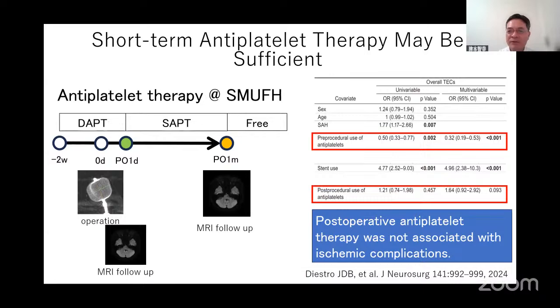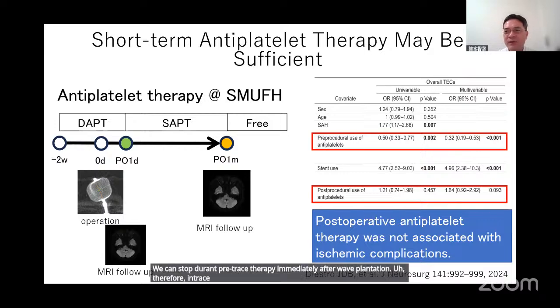And another strong point is about antiplatelet therapy after treatment. We can stop dual antiplatelet therapy immediately after WEB implantation. Therefore, intrasaccular devices are useful in treating elderly patients because they have a much higher risk of hemorrhagic complication compared to the young.